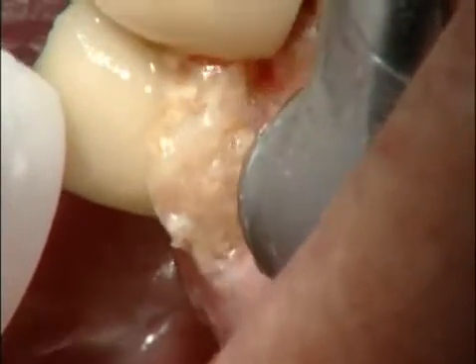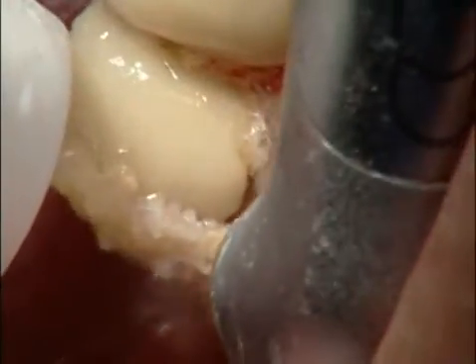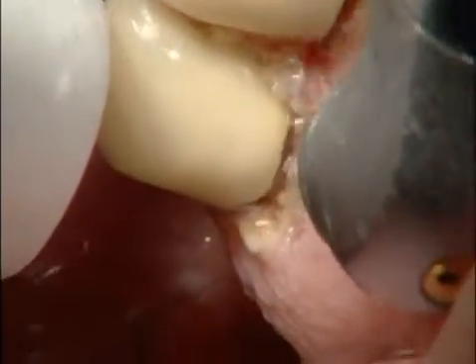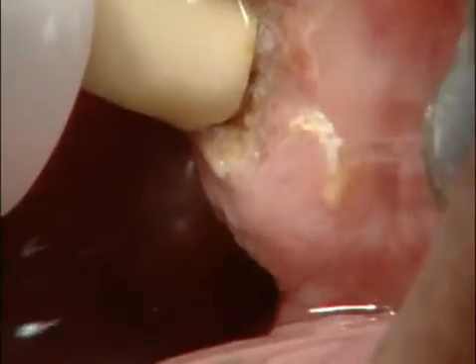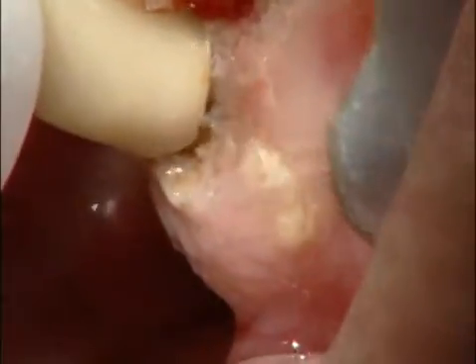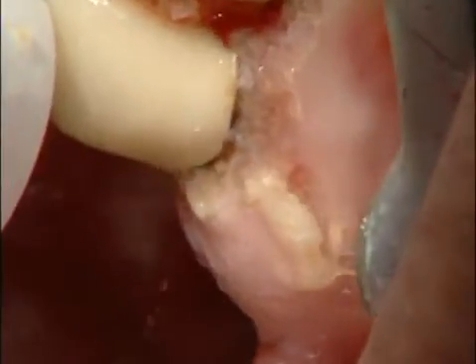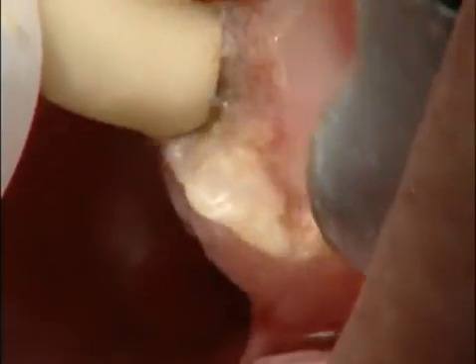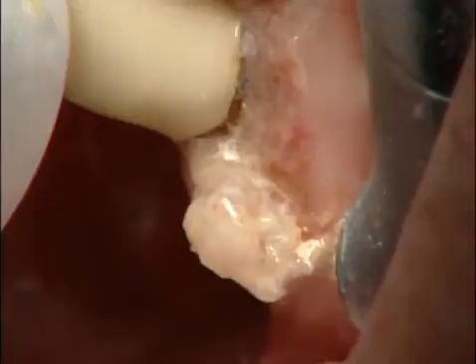So you can see that we have very little bleeding. Again, I did not stop her Coumadin treatment. With the Waterlase MD in the soft dual pulse mode, it allows me to cut deeper into more vascular tissue with better coagulation. Also, you'll see that at the gingival margin, the attached gingiva, it's a very nice smooth cut.